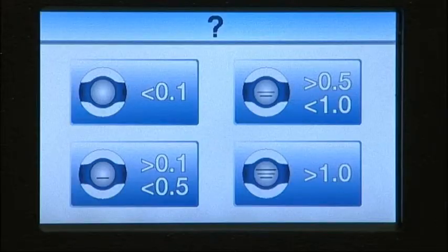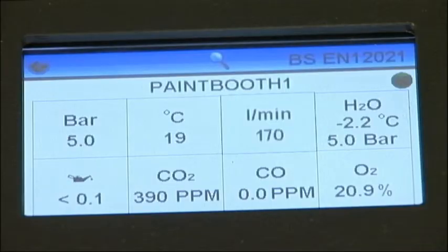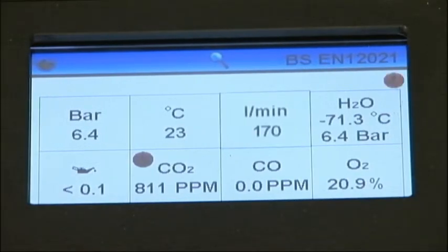Select the image from the screen which matches the results on the impactor. The test complete screen displays all the measurements recorded during the test and automatically determines whether the test was a pass or fail against the standard displayed in the top right corner of the screen. The water content is displayed as a pressure dew point. If the test was a fail, a red exclamation mark would indicate those criteria which did not meet the standard. Here's an example of a failed test where carbon dioxide failed to meet the requirements of the selected standard.